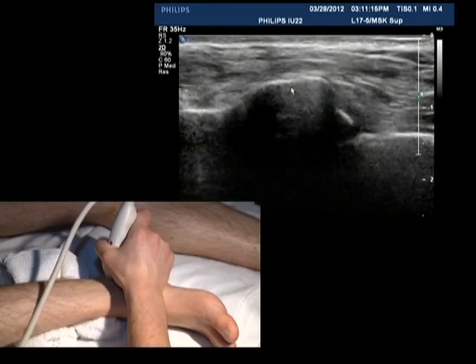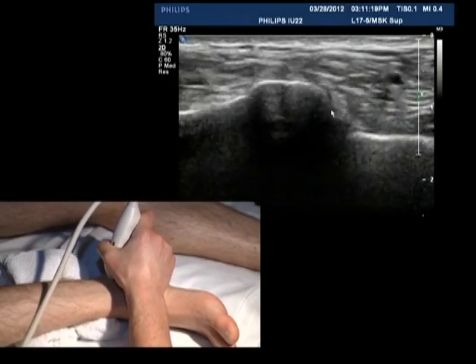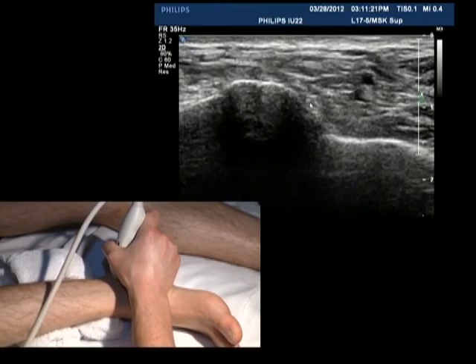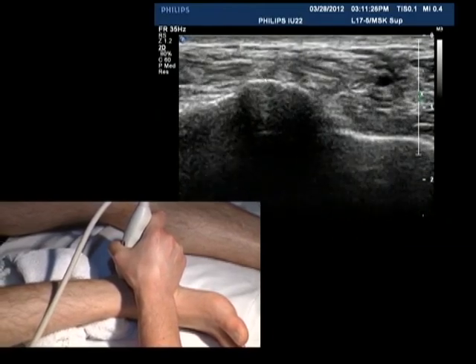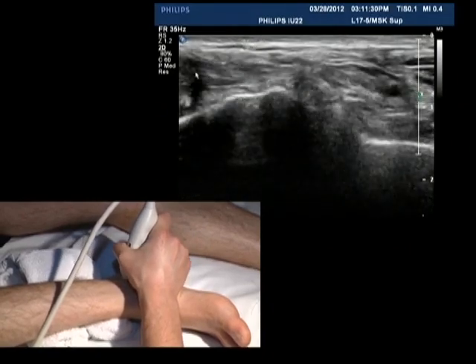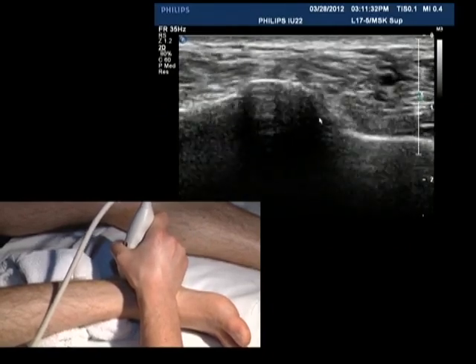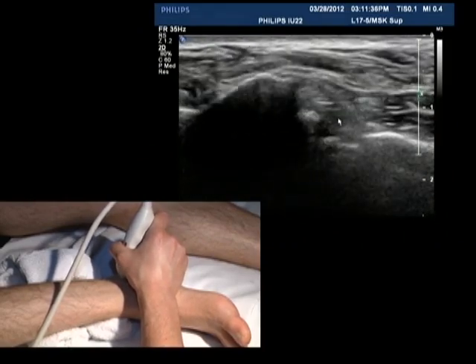And then if you want to look again, here's the sustentaculum. So here's the calcaneus, here's that portion of the calcaneus, that's the sustentaculum. And you can see here, here's the flexor hallucis longus, tibial nerve on top of that. Here's the flexor digitorum coming over that area, and then you're going to see some of the posterior tibial tendon right there. So if you can identify that nice portion of the calcaneus, you can actually see the structures quite well.